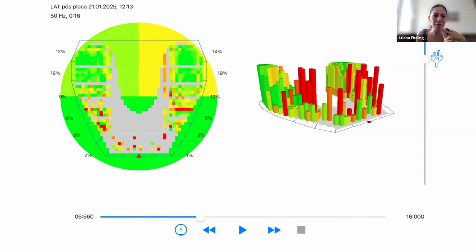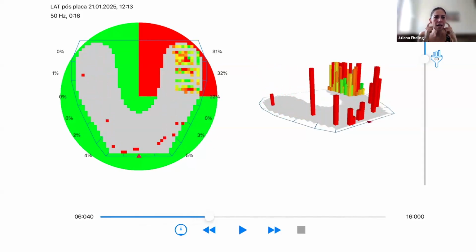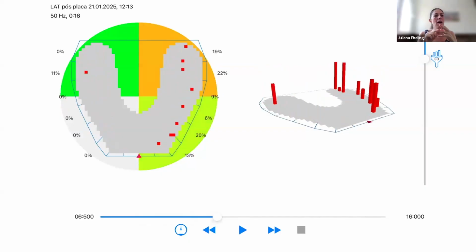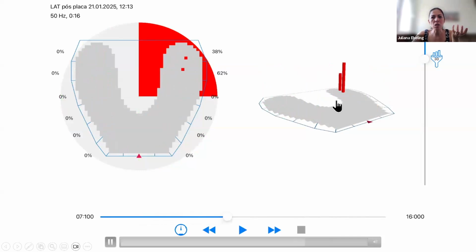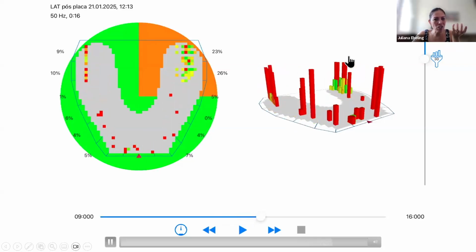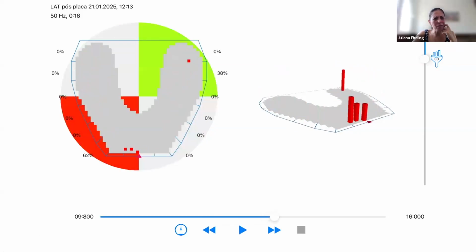This is very, very rich information for joint health, for sensitivities. This is really, really important. Why? Sometimes we have a canine guidance, but we have this interference. And you look, oh, this is working well.